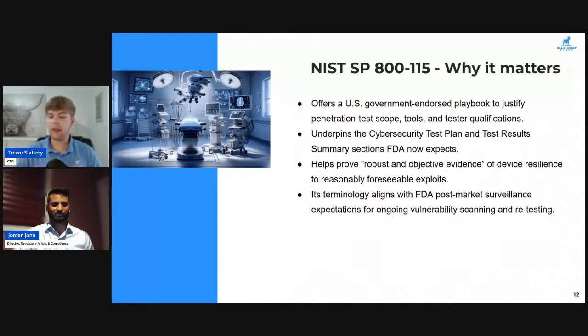And the FDA, they want to work with you. They want to be understanding. So oftentimes they'll come back and say, great, thanks for providing that plan. Let us know when you have the evidence that you've executed it, and we'll fast track this process. And so they're still going to want to see this remediation test come through, regardless of how you try to explain around it. So I think it's something that is important to keep in mind when you're trying to plan out the timeframes for this.